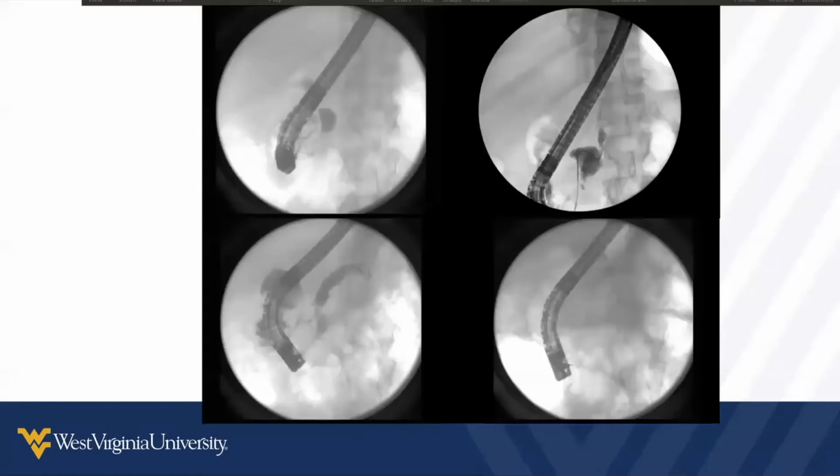And here's just an example of a patient with hereditary pancreatitis and acute recurrent pancreatitis in whom we performed ERCP. And on pancreatogram, what you can see here is the pseudocyst is in communication with the main pancreatic duct, and as we continue to inject, we can opacify an upstream pancreatic duct. We can then send a wire deep into that upstream duct and ultimately place a stent to allow this stricture and pseudocyst to heal and ultimately treat the episodes of acute recurrent pancreatitis. This patient did great. His pancreatitis episodes resolved, and he's done well since.